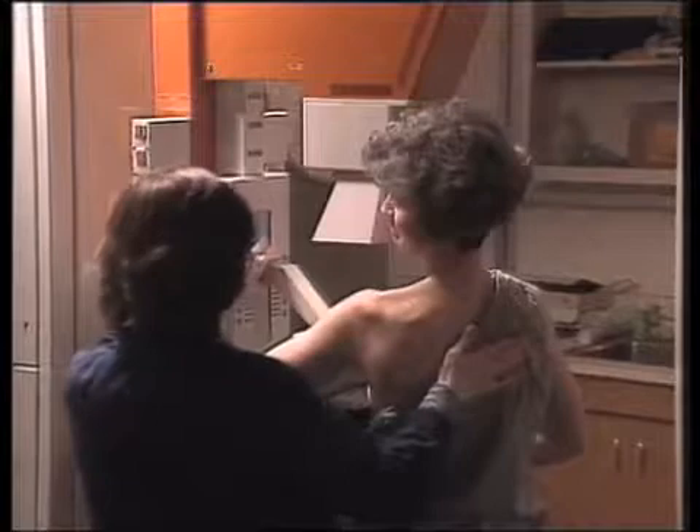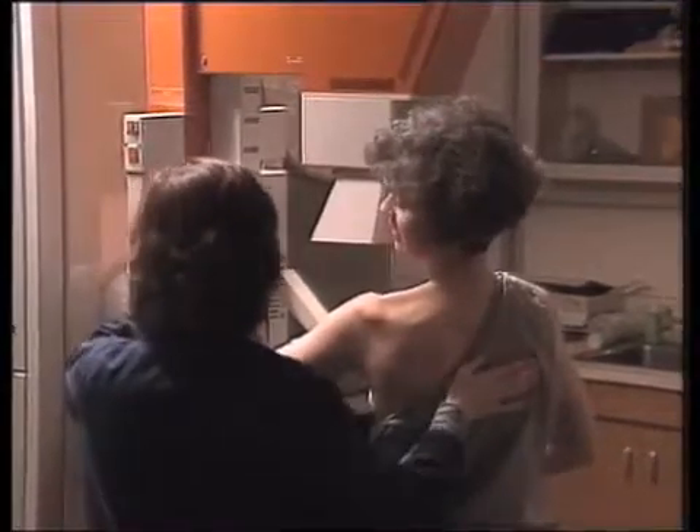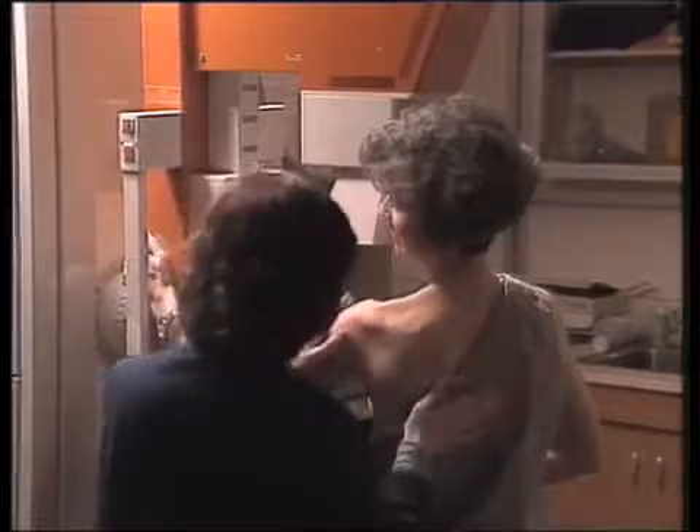It's not too tight — it should be a little tighter. No, that's fine. You're not too uncomfortable? No. Okay, now I'm going to strap this shoulder again.